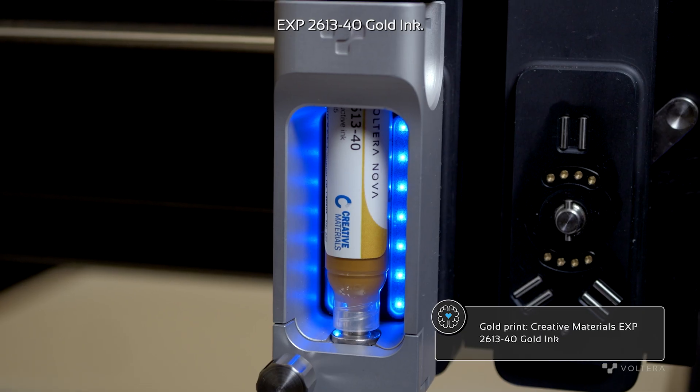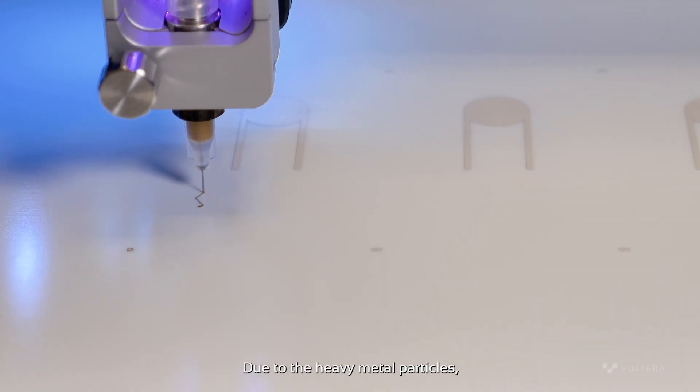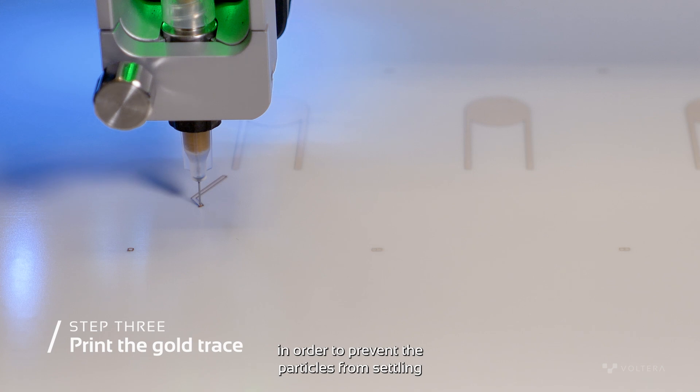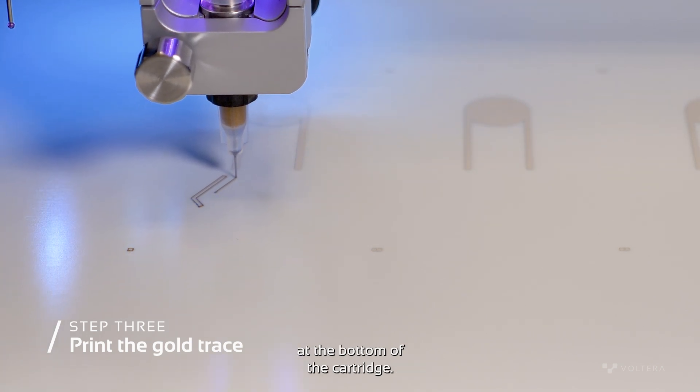Our third and final print is done with Creative Materials EXP 2613-40 gold ink. Due to the heavy metal particles, the gold ink had to be mixed immediately before printing in order to prevent the particles from settling at the bottom of the cartridge.